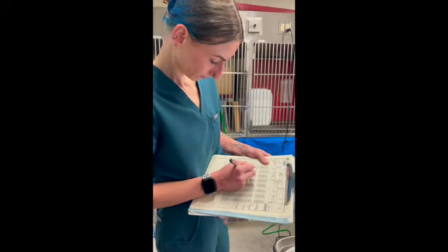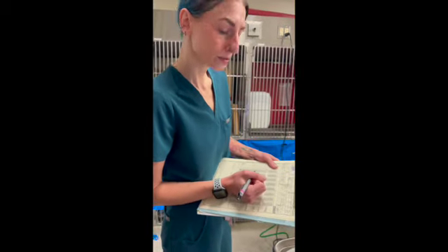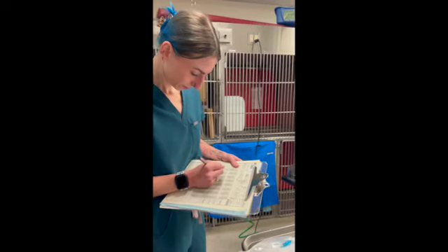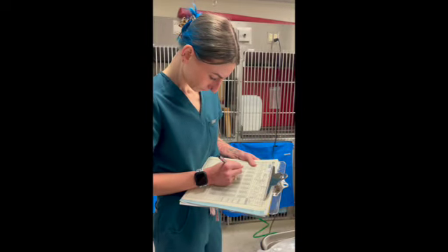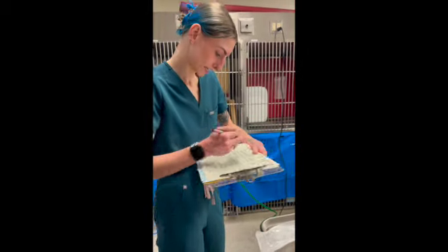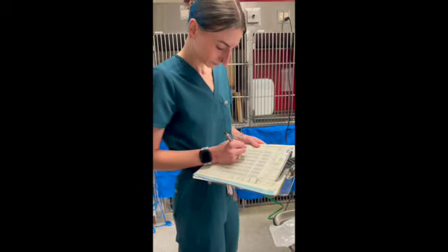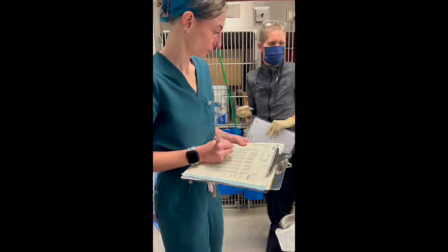And his diastolic is at 87. And his mean pressure is 95. His SpO2 is 99%. Temperature is 100.2.